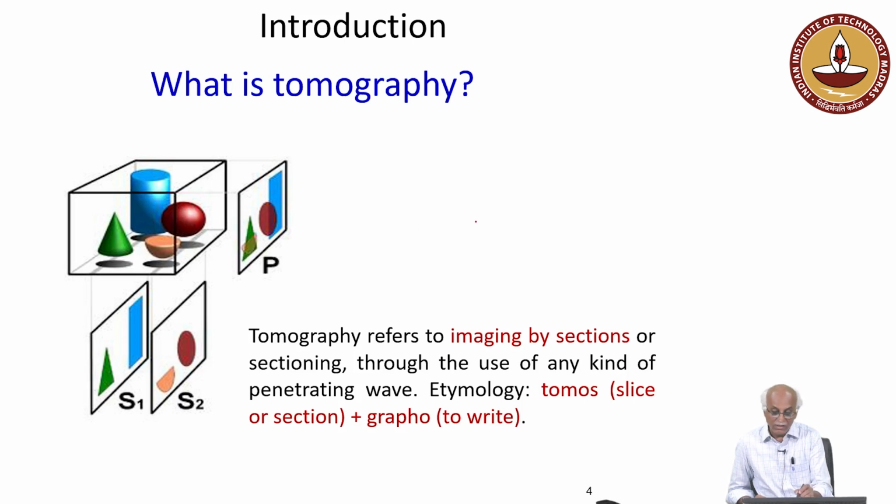If we see from the side view, from the right side, we will see an overlap of a sphere with a cylinder, hemisphere, cone. If I see from the front, there will also be some overlap of components, but I will not know how these components are placed.